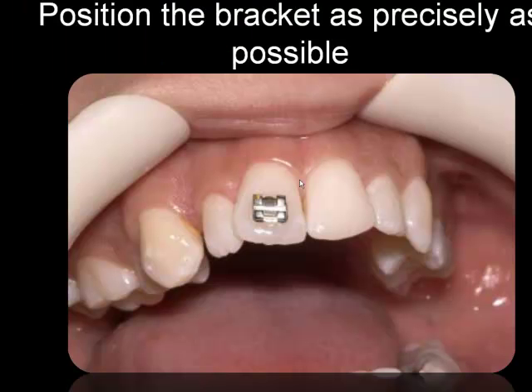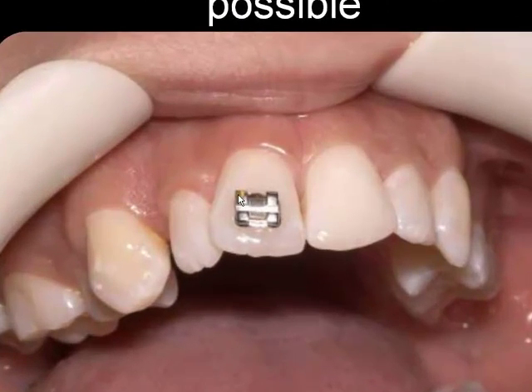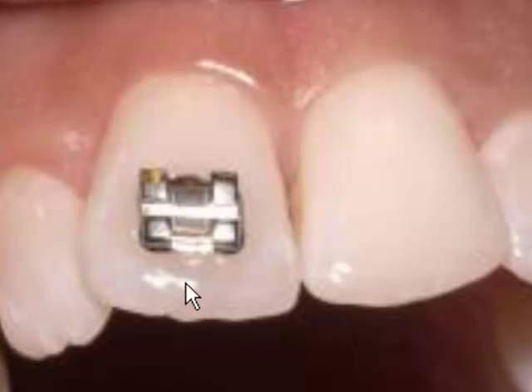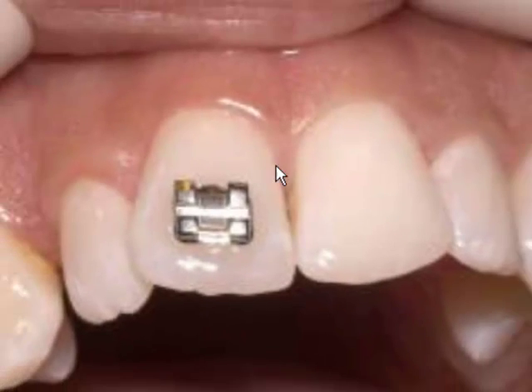Now you isolate this tooth from the others and position the bracket as best you can. Then you measure the height from the incisal edge and center the bracket mesiodistally, ensuring that the incisal ledge of the bracket is parallel to the incisal edge of the tooth. There are variations in anatomy — this central incisor is different from that one — so there may be slight modifications when bracketing to achieve the proper gingival level, and there may be some differences in the two bracket placements on the same patient.